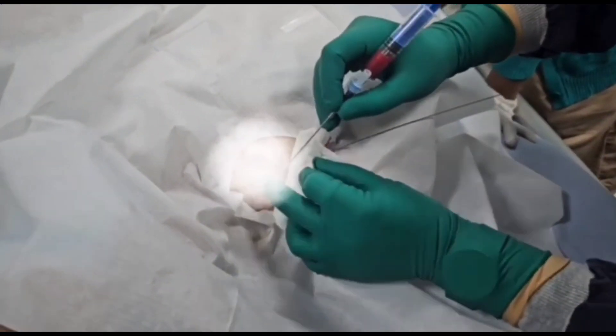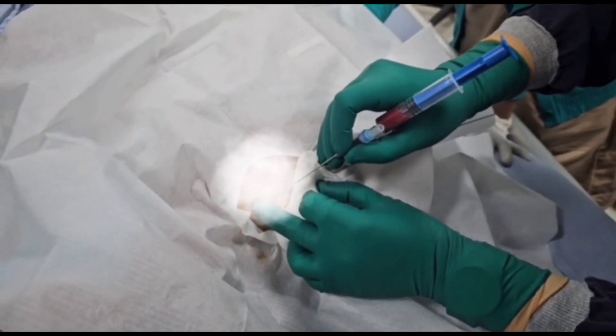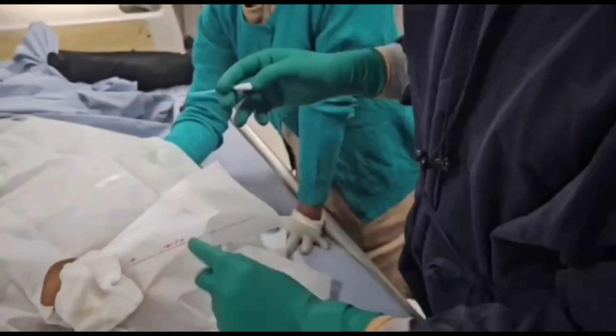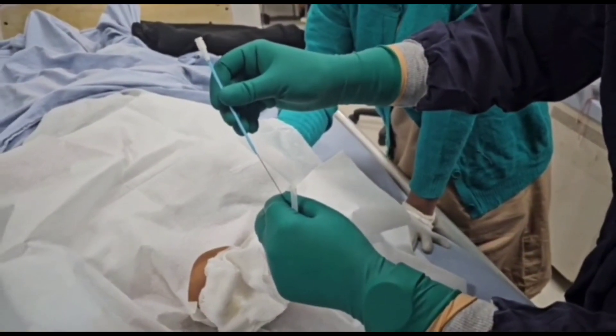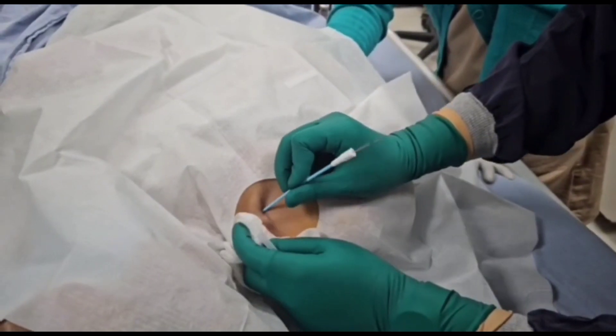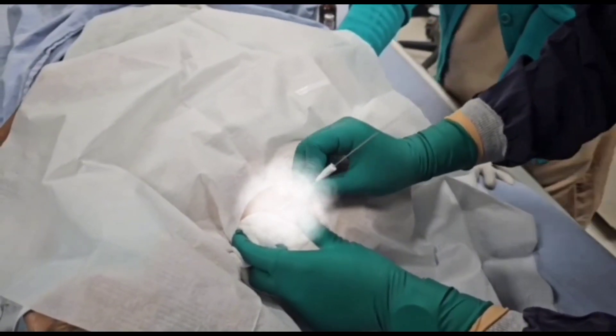Then we slightly enlarge the puncture site — not too much. We then pass the dilator over the guidewire to dilate the skin and subcutaneous structures for easy passage of the central venous line.